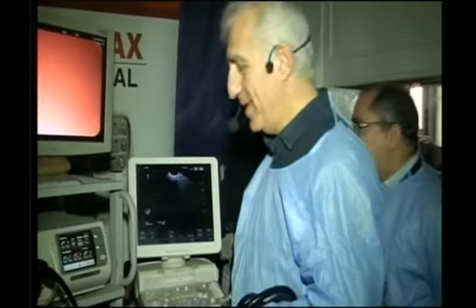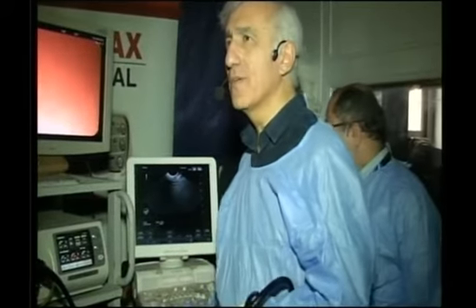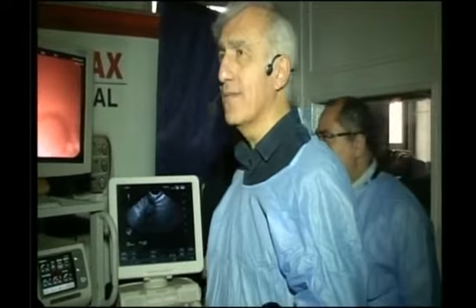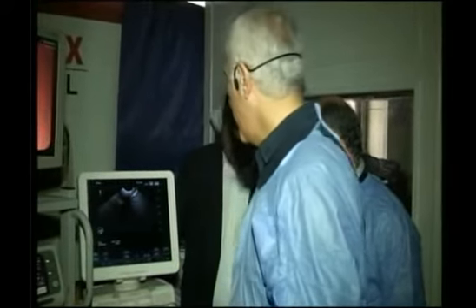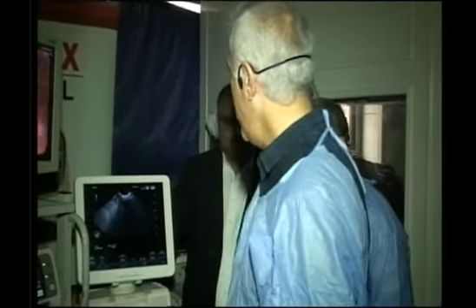Ladies and gentlemen, first of all, I would like to thank the organizers of this meeting for inviting me to Egypt. This is a fascinating country and city every time. I am here examining a patient with a presumably papillary tumor, with my dear friend, Professor Okasha. We have been working together for the last 4 years, and I am very happy to be with him again.